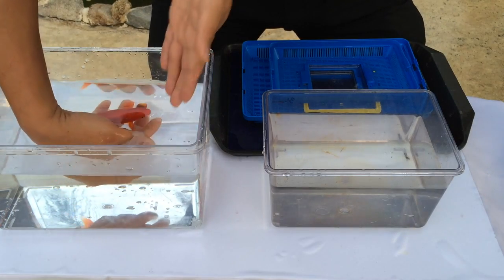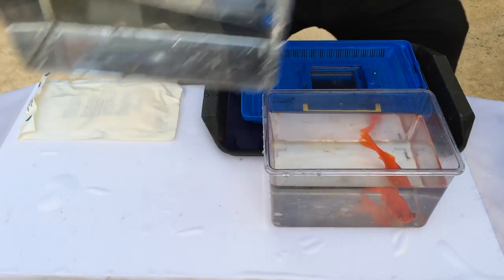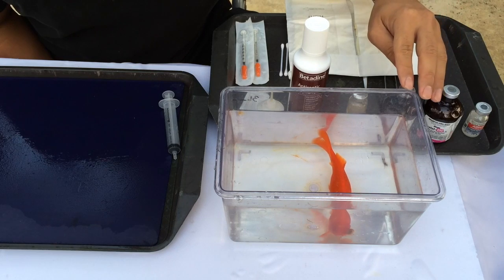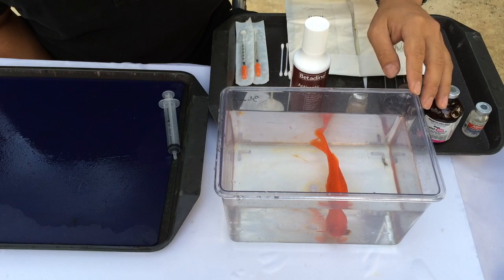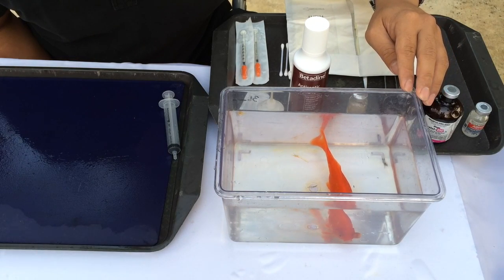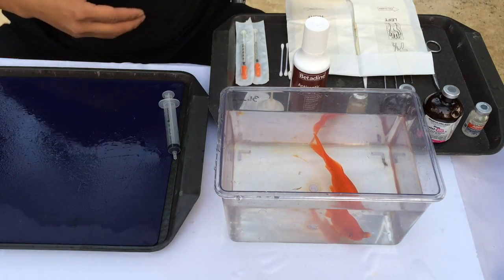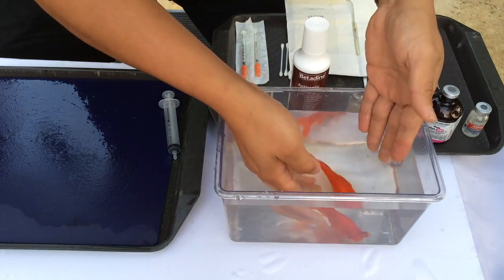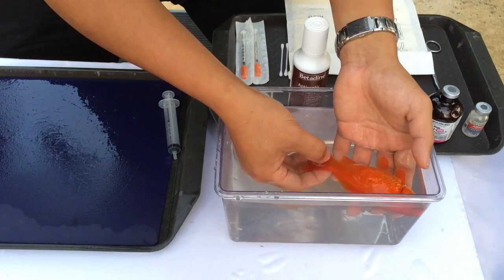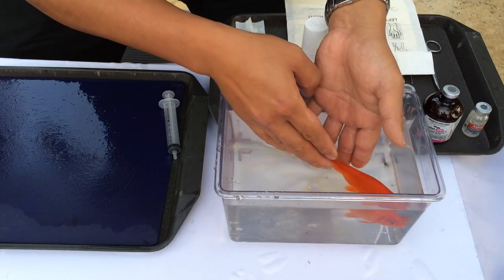So now we're going to put Fred into the anaesthetic. Gently hold him with wet hands and transfer him in. We'll wait for that to take effect. You can see he's getting anaesthetized — his opercular movement is getting fast and erratic, and now it's actually stopped, so we know we're at a decent level of anaesthesia. To confirm he's suitably anaesthetized for this painful procedure, we do a pinch test at the caudal peduncle — the base of the tail fin, similar to the membrane pinch test we do for dogs and cats. There's slight reaction, which means he can still feel pain, so we need to leave him in the anaesthetic solution a little longer.